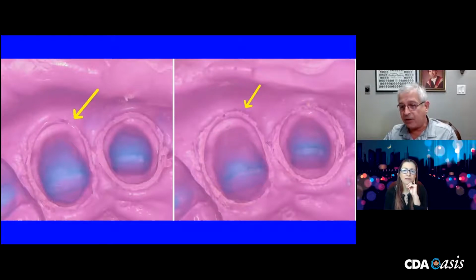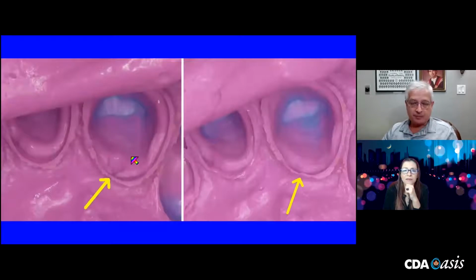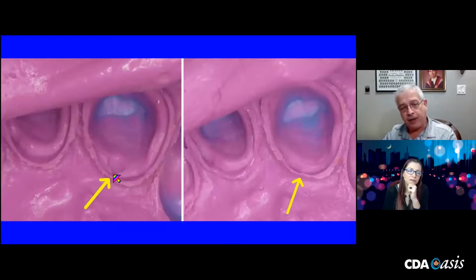You want, obviously, all of your prepared tooth structure and the margin and a little bit beyond. You have to see a little bit beyond the margin, so it's defined for the lab technician. In this case, in this same impression, I had a void. Now, if the void was up here, I wouldn't stress it that much because at least the margin would have been captured.